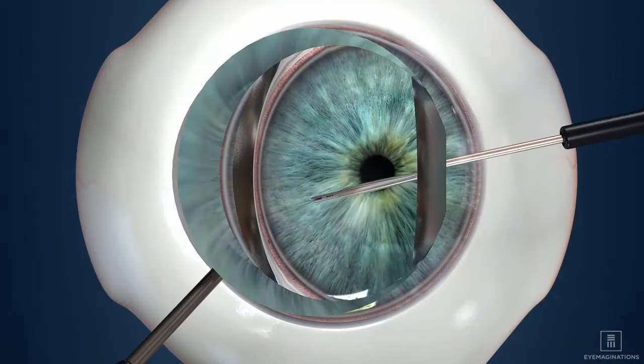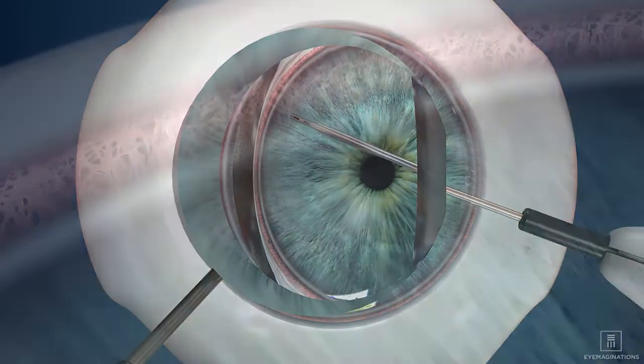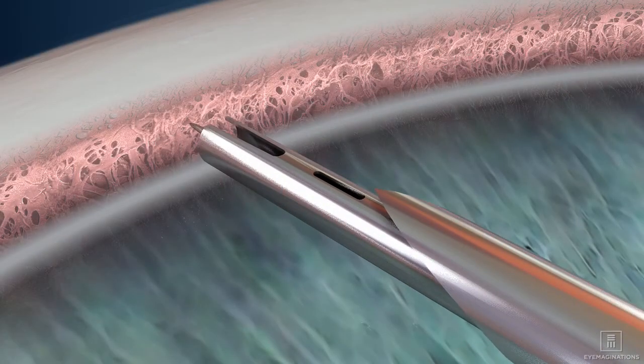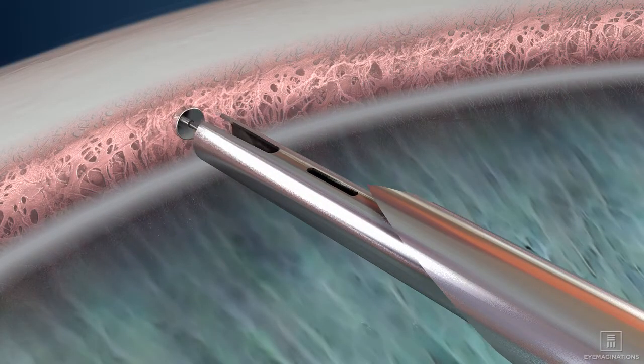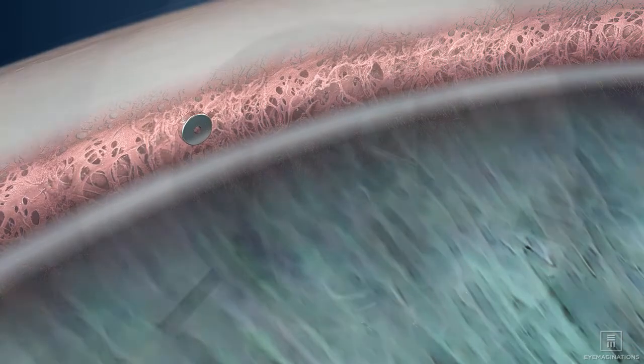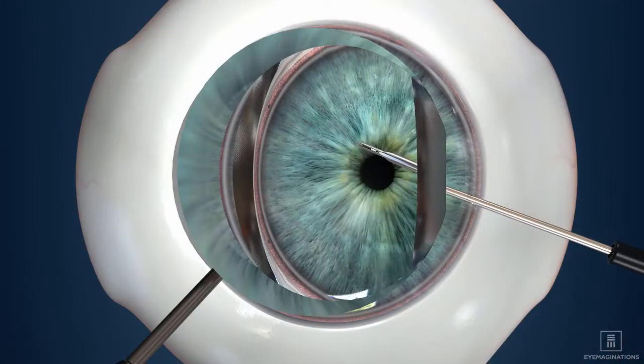The handpiece is then rotated and the second Eye Stent Inject is placed, creating an additional pathway for fluid to drain. The handpiece is then withdrawn from your eye.